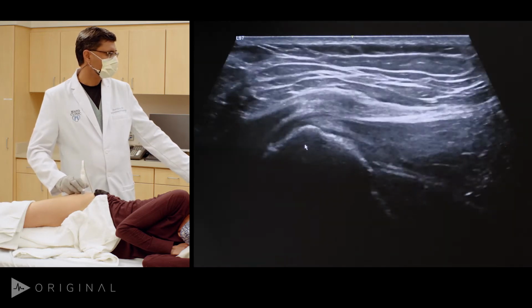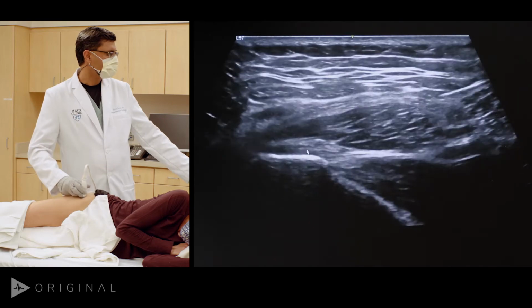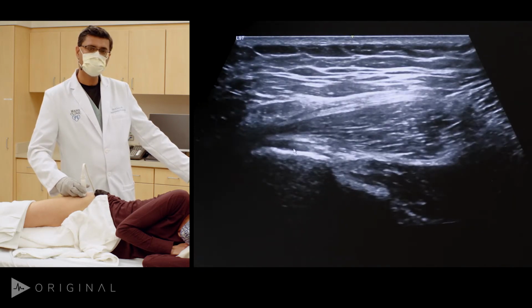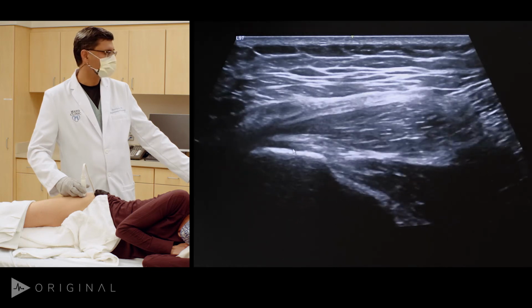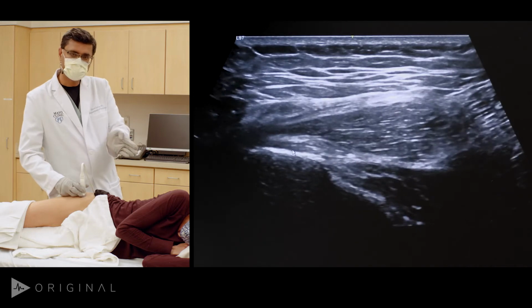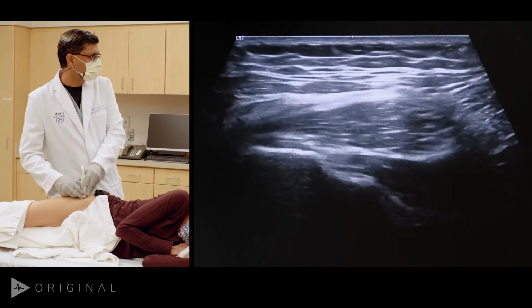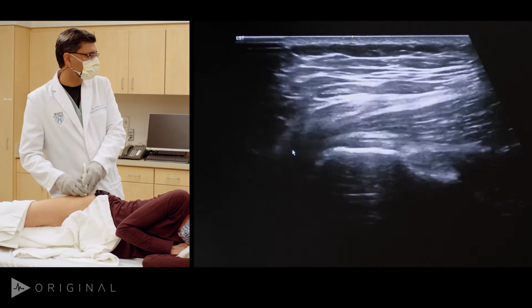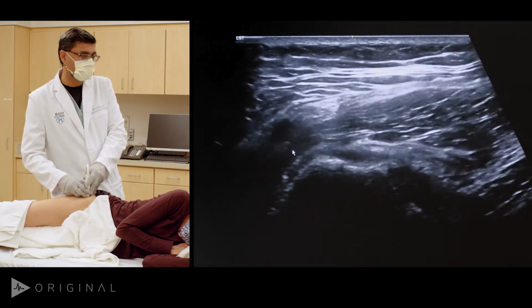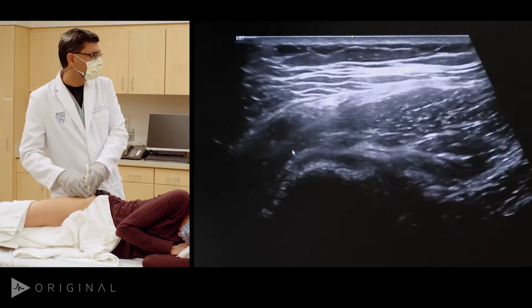And I can very easily make it hypoechoic, which is the anisotropy. So I have to make sure I angulate properly, okay? So we find the ridge there, go anteriorly, and then make an angle so that the insertion of the gluteus minimus tendon is hyperechoic. This tendon moves anteriorly towards the iliac crest. So I can keep this in view in the center of the screen and move anteriorly, but in my mind, I'm going anterior towards the insertion.